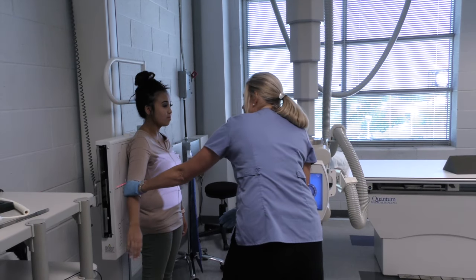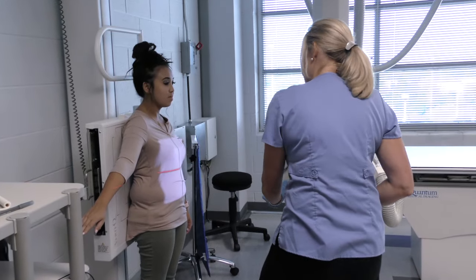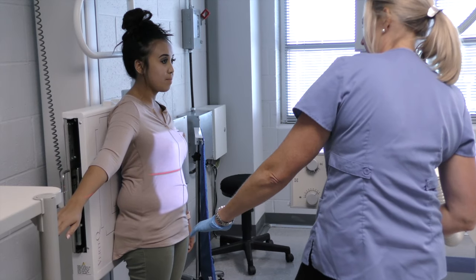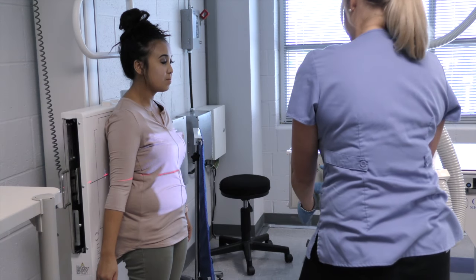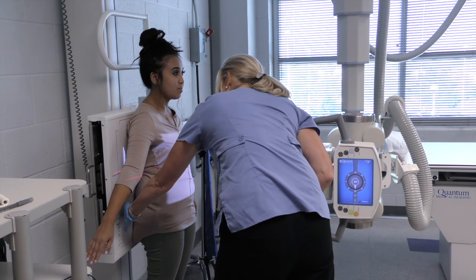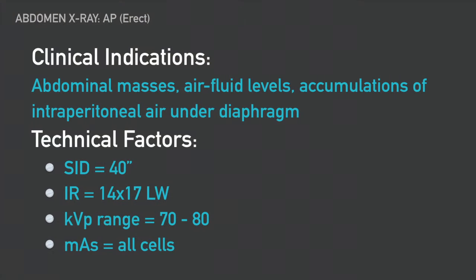If you'll raise your arm — a good tip is that the top of the light is right at the very tip of her arm and hip. You can relax your arm, and spread them out just a little bit. Put your marker in the lower right or left-hand corner.